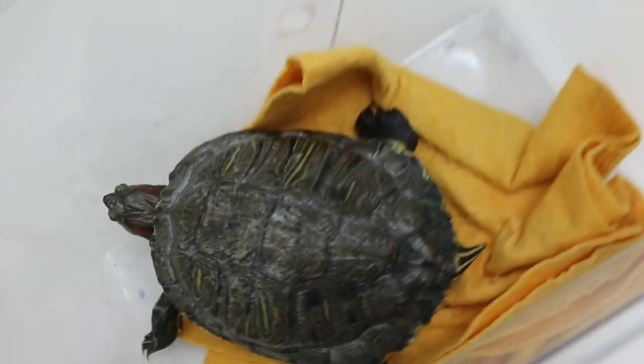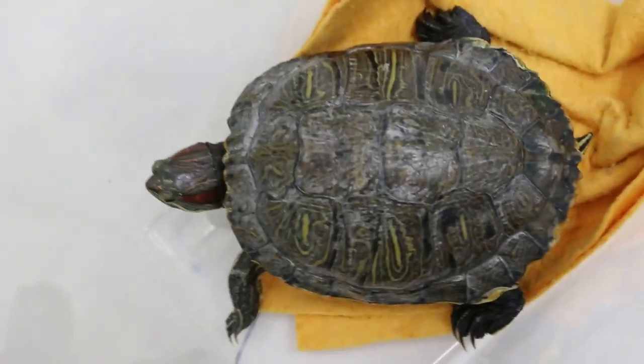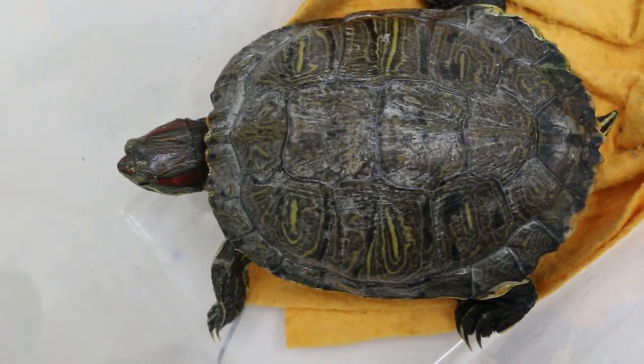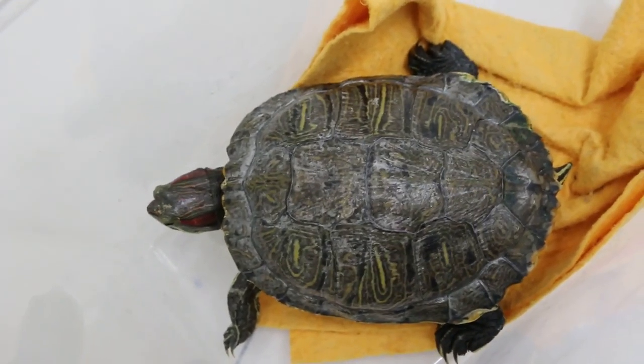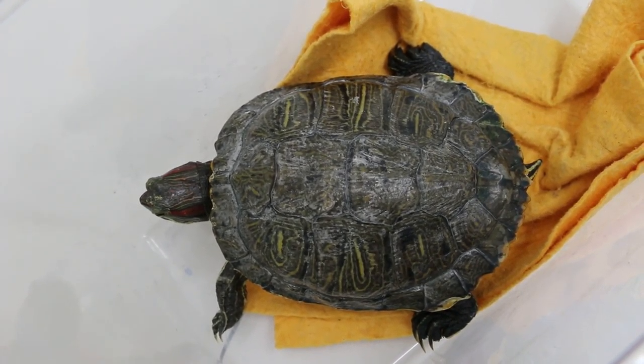Dr. Daniel stuck out the yolk and the egg shell collapsed and was then pulled out. That was three days ago, but now the owner complained that the tortoise is not eating — has not been eating for the last three days. So I believe there will be more eggs inside. We are doing an x-ray now.